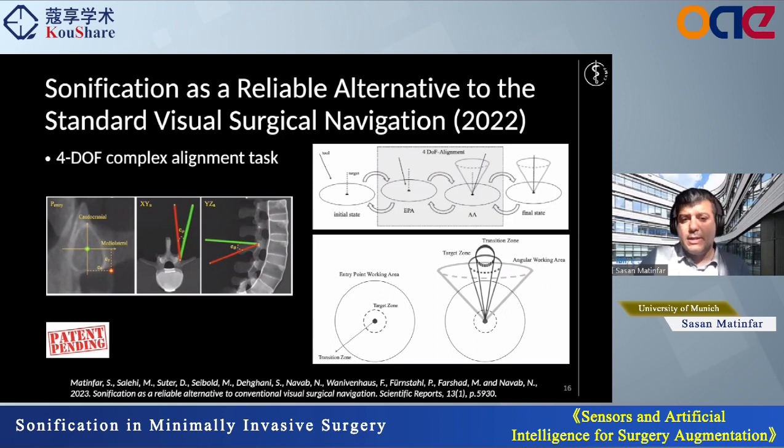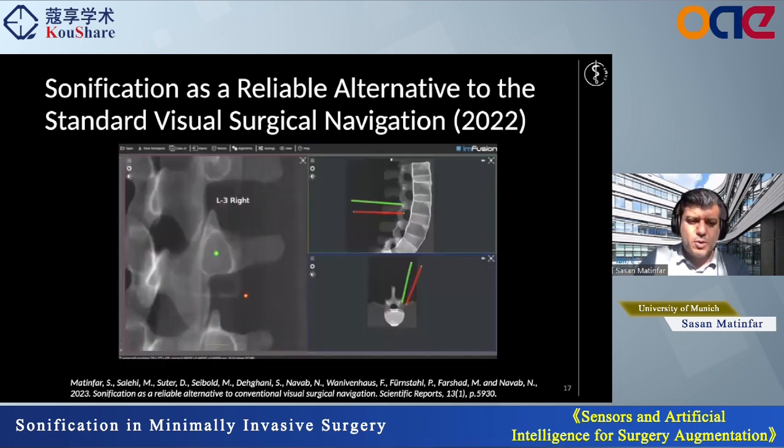So we divided the task into 2 sequential phases. First, we fixed the entry point, and then the angular deviation. This is a very short example of the method and the experiment we have done at Balgrist Hospital in Zurich.